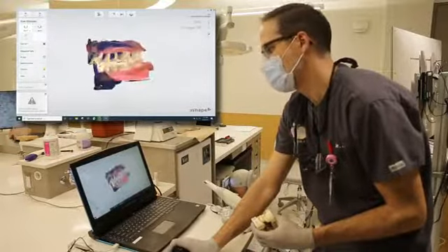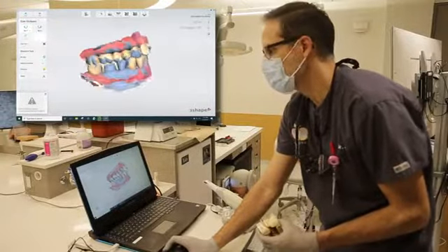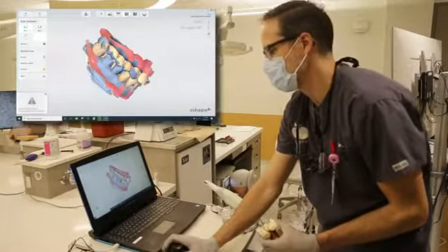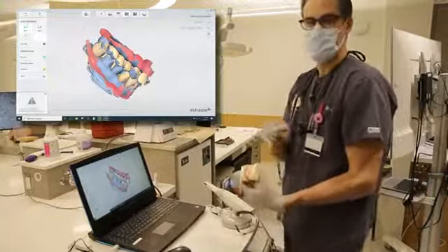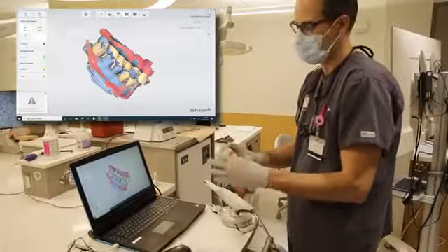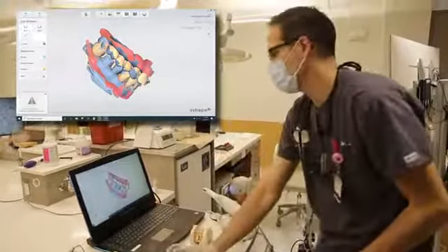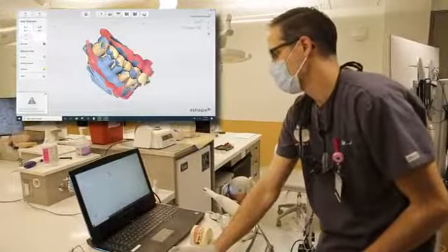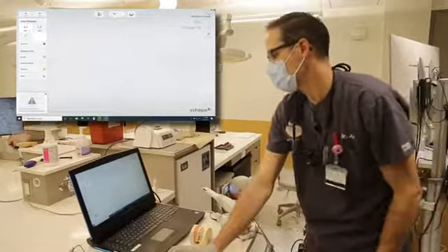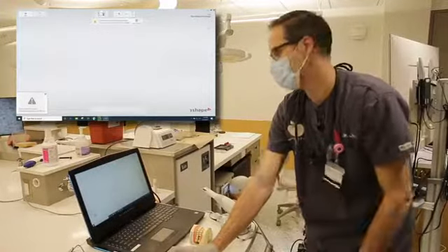So this is actually how our teeth come together. This is a really accurate representation of how they fit. And one of the things that we can do that's really nice for our students, because a lot of times they have difficulty evaluating the amount of space between the teeth. Obviously, when the patient's biting down, if the tongue or the cheek are in the way, it becomes a little bit more challenging to really judge that distance. We have the ability now with a quick scan to evaluate this in that three-dimensional view and really see if there's actually enough space for the material that we've chosen.